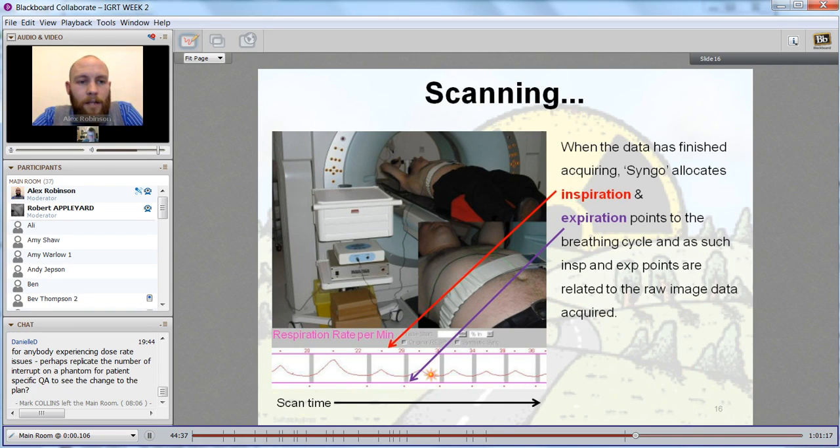The other patients that you have to consider, Rob, is that when we think about lung patients, often it's due to smoking and patient age. The older they become, the more likely they are to get lung cancer. So we get quite a few really skinny patients where you get this hollow.